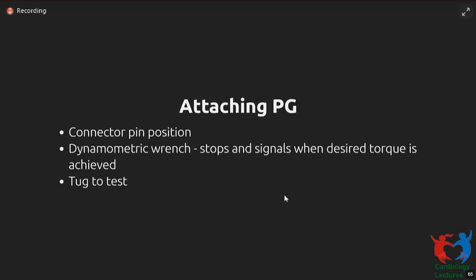And for fixing, you always come with a screw, and that is covered with a sort of silicone valve. So gently put the screwdriver through that, and then you rotate clockwise. And this wrench is called a dynamometric wrench. So what it does is, it'll only provide torque until a certain level of torque is reached. So if there is resistance beyond a certain level, while you're rotating the handle, the distal screwdriver itself doesn't really rotate. And then it produces a noise also to tell you that it has stopped rotation. So once you hear the noise, it means you're not transmitting any more torque and you can stop at that point. Always pull back on the lead, a gentle tug, to see that it is fixed well.